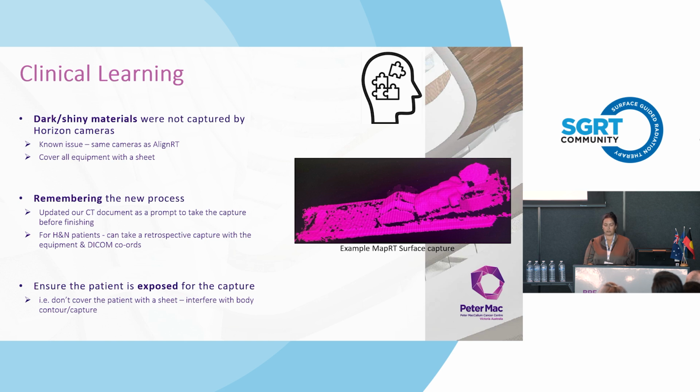Secondly, we found that as with any new process, remembering to perform the capture before automatically going into the CT room and getting the patient down and off the bed was a little problematic at the start. To help prompt our staff to remember the new process, we updated our CT document with a MapRT section to fill out. We found that this really helped with the uptake of our MapRT captures being taken.